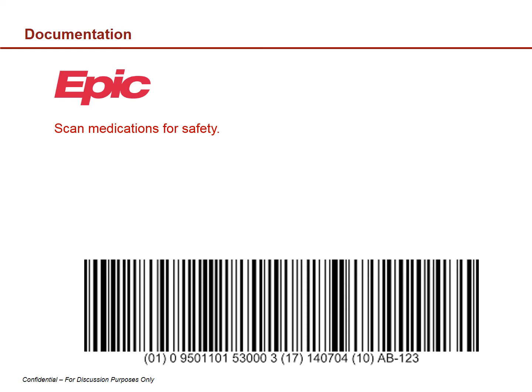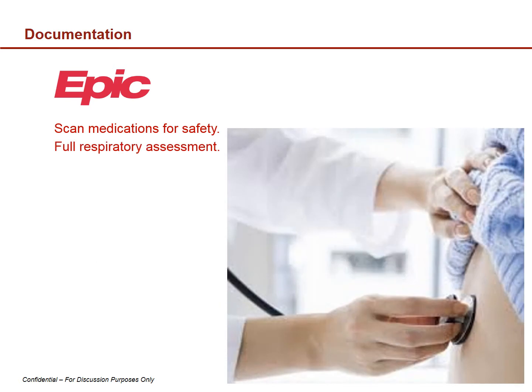A full respiratory assessment, including the patient's level of consciousness, pulse and respiratory rate, oxygen device and saturation, and breath sounds, should be completed and documented upon the initiation of a treatment. A reassessment of previous parameters, along with the patient's tolerance and appearance of any adverse effects, should be noted upon completion of therapy or at least every hour when on continuous nebulization of albuterol in the emergency room.